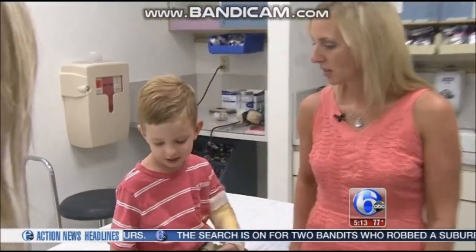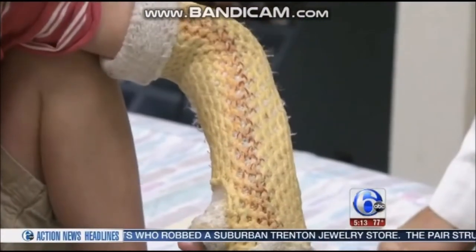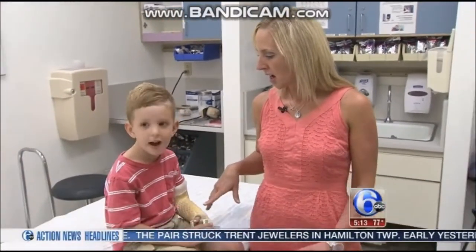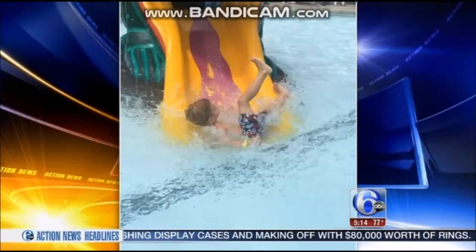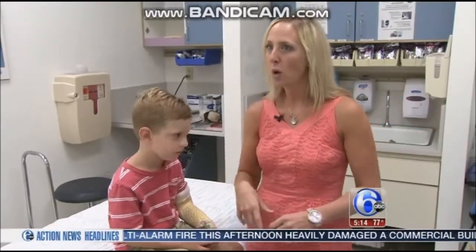Four-year-old Brayden Green was playing with his cousins, and that's how he broke his arm for the second time this summer. With the first, his mother says he was in a conventional cast which he couldn't get wet at all. But this new cast called Osteofix is lighter and it can get wet. In the summer he can go in the pools so he can still go swimming, he can take baths and play in the bathtub without having to have his arm elevated or out of the water.